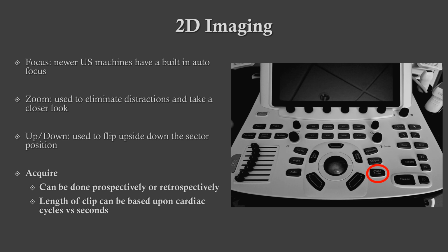This is something that can be pre-selected under utility configuration tabs, and the length of the clip can be based upon cardiac cycle versus seconds.